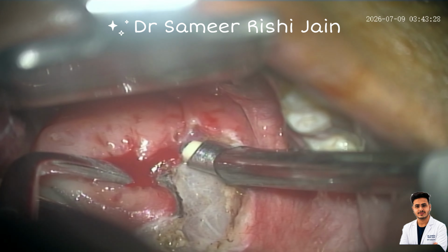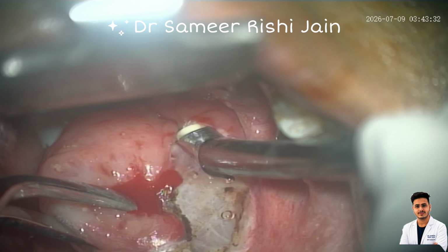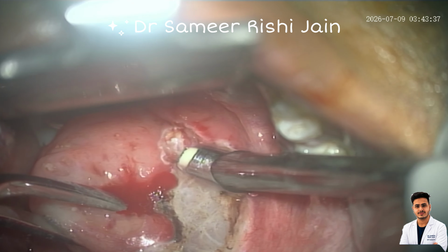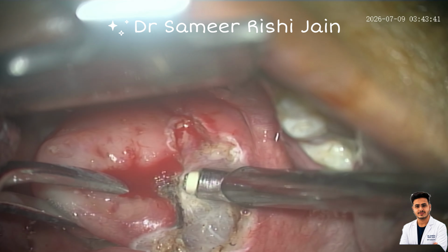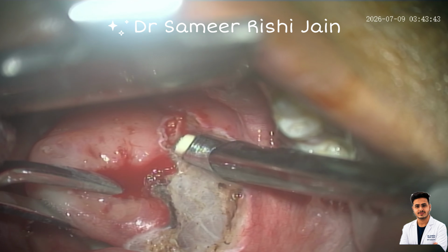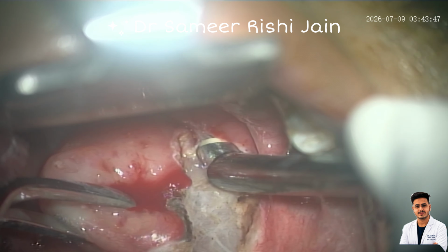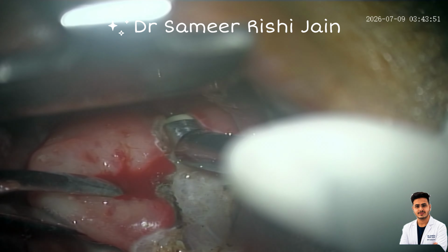We have to divide the connective tissue and not the muscle fibers. We have to prevent opening up of the fascia, as opening up of the fascia will lead to the exposure of the floor muscles, tonsillar bed muscles, and it will lead to a complication of post-operative pain.